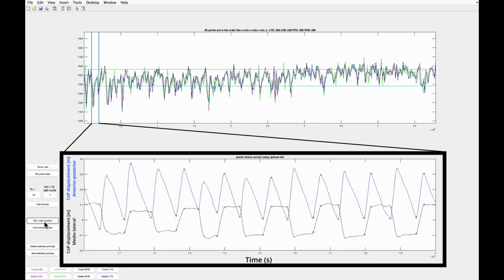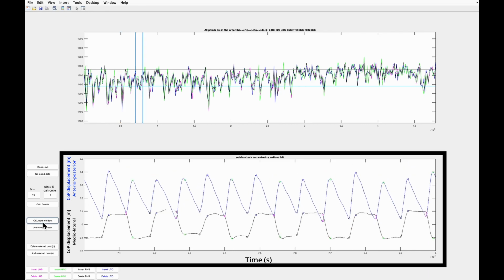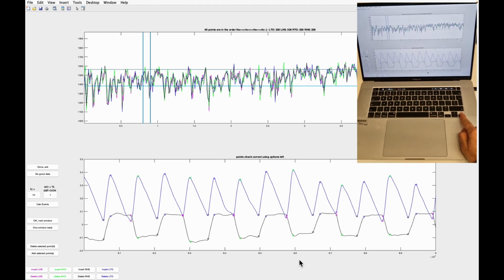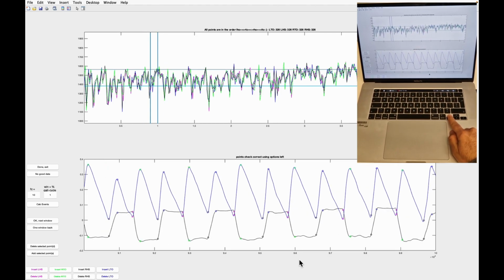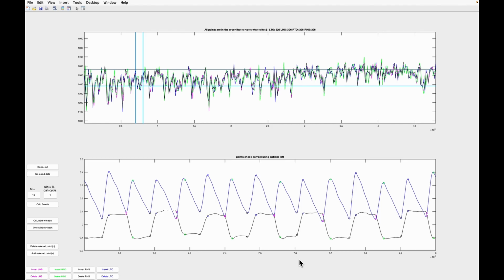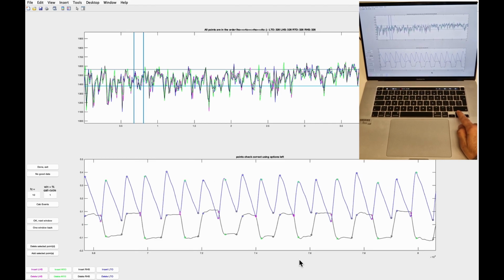Using the OK Next window button, you can shift these lines forward. To revert to the previous window, click the One Window Back button. You can also navigate the window forward and backward using the right and left arrow keys on your keyboard. You can zoom in and out using up and down arrow keys respectively.